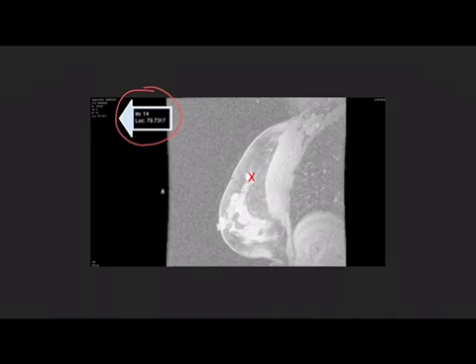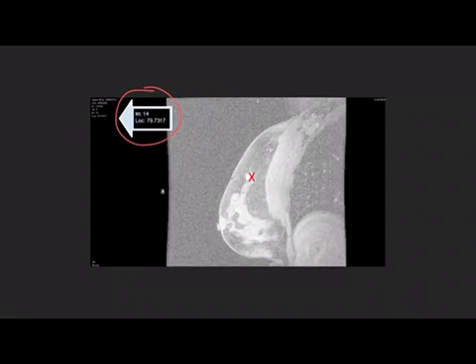The first thing I'm going to do is identify my location of the sagittal slice. Here it's at 79.7 millimeters, image 14. I'm going to put an X on the lesion, and then you scroll back until you find the grid.